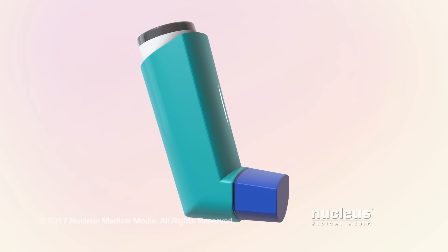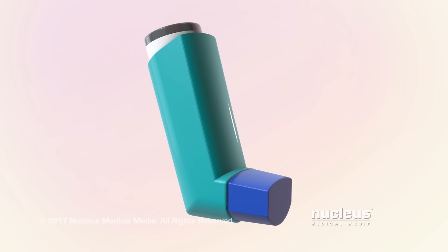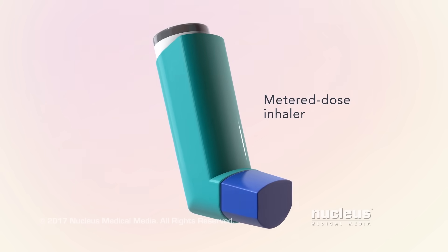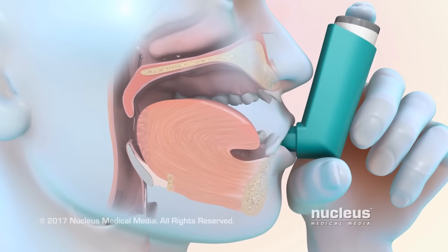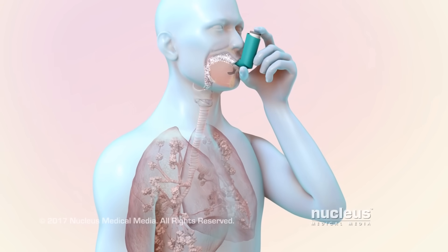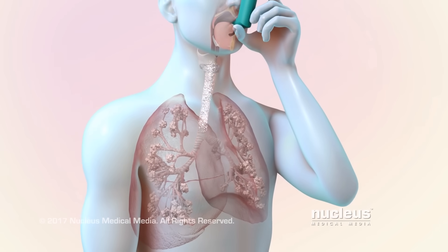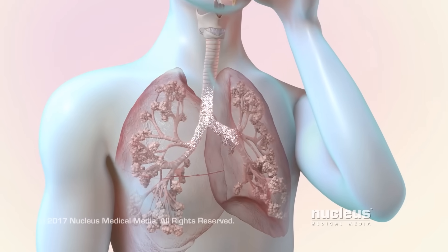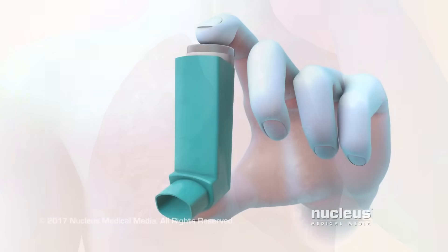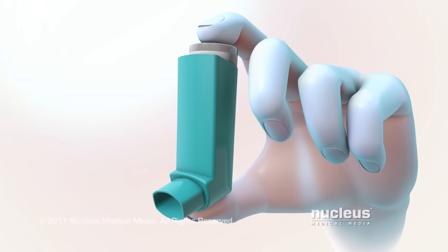People who have lung conditions, like asthma or COPD, often take their medications using a handheld device called a metered dose inhaler, or MDI. A metered dose inhaler sprays medicine through your mouth so that it can reach your airways. If your inhaler is not used the right way, some medicine may not enter your mouth, or some may remain in the back of your mouth. Either way, it may not reach your airways where it is needed. This video will show you the general steps for using an inhaler correctly.